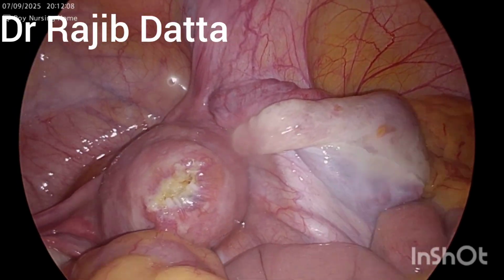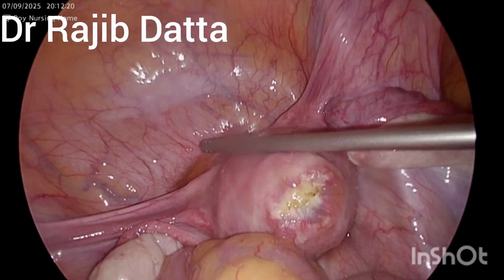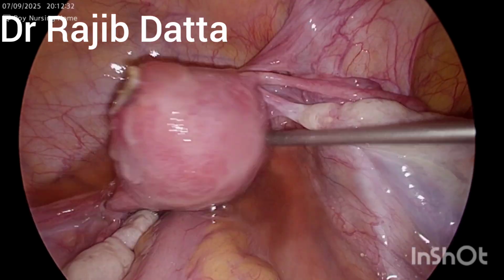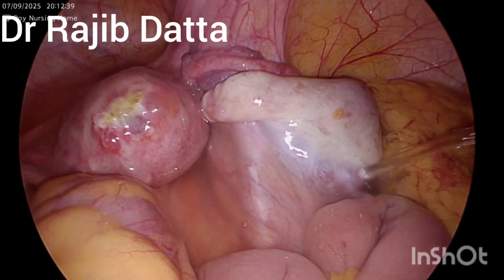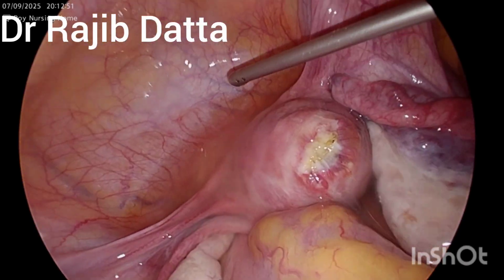You can appreciate that there could be a fundal fibroma, and thorough peritoneal lavage is going on with the help of warm saline, and the adenomyomatic changes of the uterus are noticeable, and the ovaries are enlarged, the fallopian tube is engorged here.